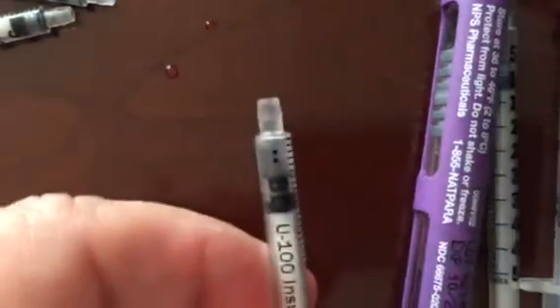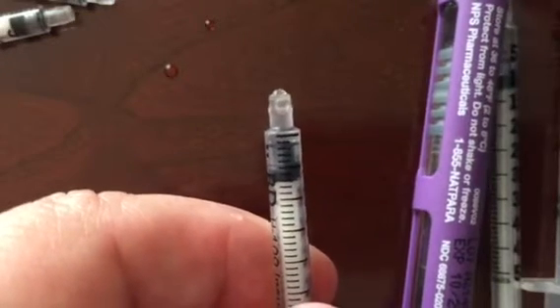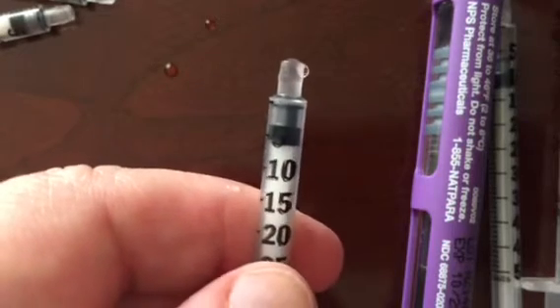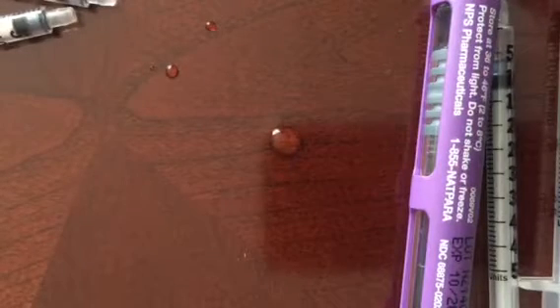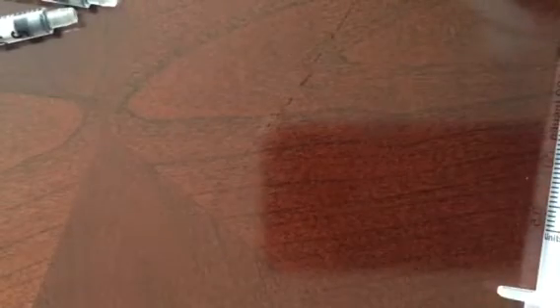Day 7. All the air bubbles to the top. Oops, there we go. Pushed too far up there. All right, so that day doesn't count because I dropped some of it. So I have no idea if that's accurate or not. It's only 4, but so day 7, I screwed up, so it won't be an accurate test for day 7.